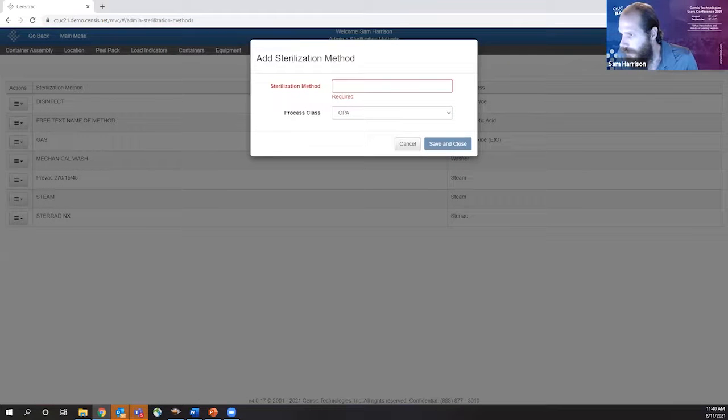When we put ATP results in the comments box when the scope is clean before it goes to the AER. I'm guessing that means the leak test comment box, because if it's before it goes to the AER, then that disinfection load hasn't been created yet.